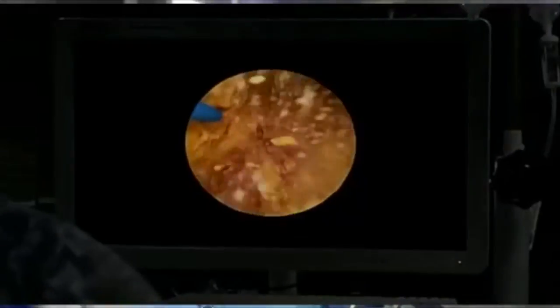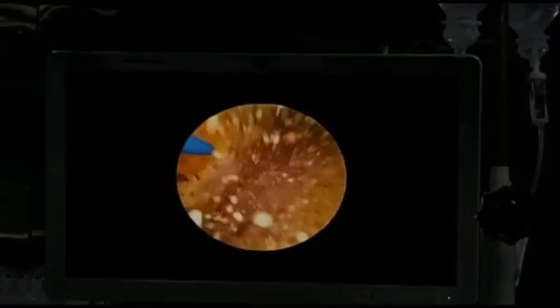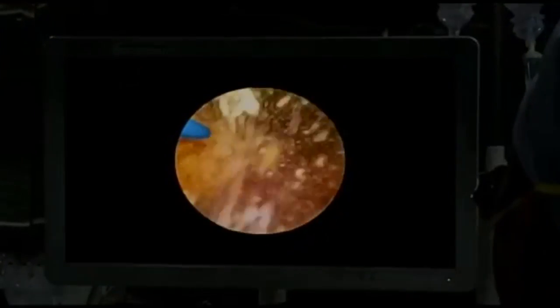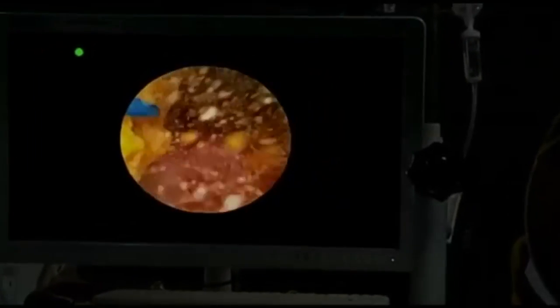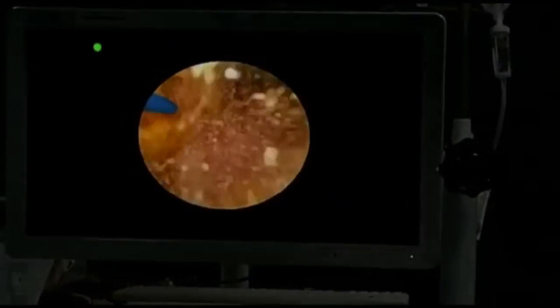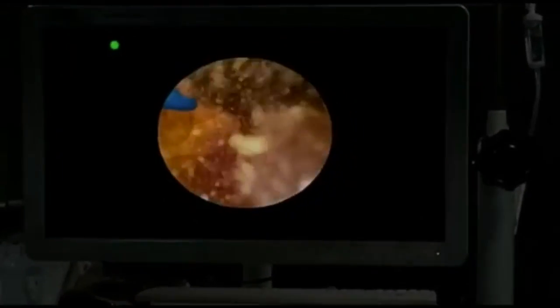Irrigation was adequate. This is a uric acid stone — the first time I have used this scope for a large uric acid stone in the kidney. Vision is good. The entire surgery took around 40 minutes for a 2.5 to 3 cm stone. Classical dusting was performed using a thulium fiber laser in this case.